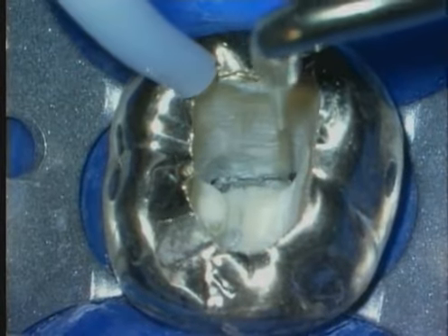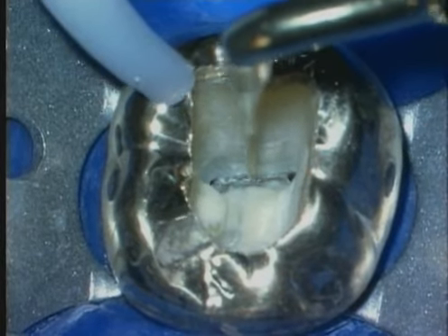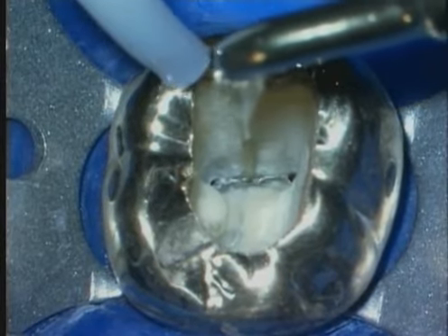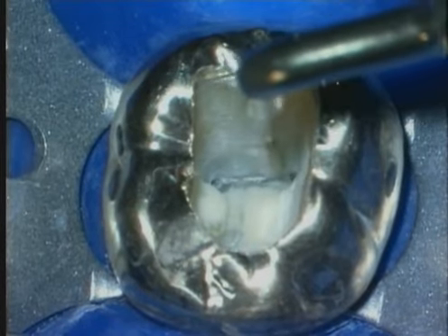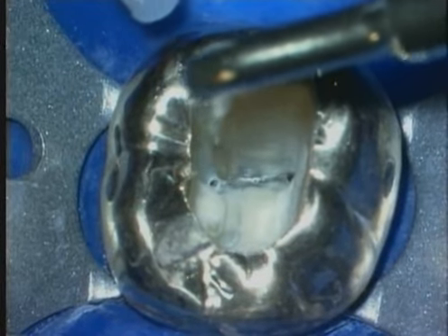Microscopes in combination with ultrasonics allow us to perform microsonic techniques. Notice the assistant using continuous air as we sand away tooth structure precisely. Notice when no air is blown into the access preparation, debris accumulates rapidly due to the cutting efficiency of the ultrasonic instrument. Use this instrument in a painting brush-like motion. Here we've uncovered an extra orifice between the MB and the ML orifices. With the tip of the file engaged, we get handle flutter.